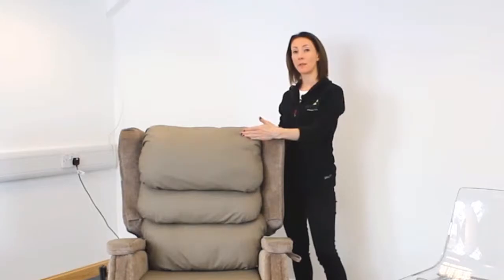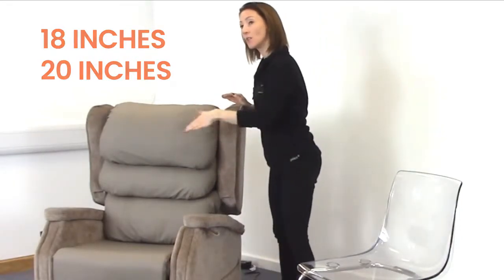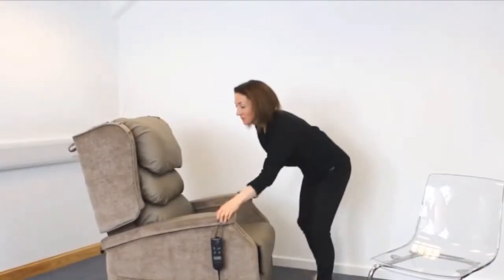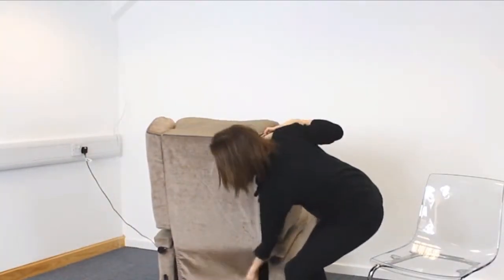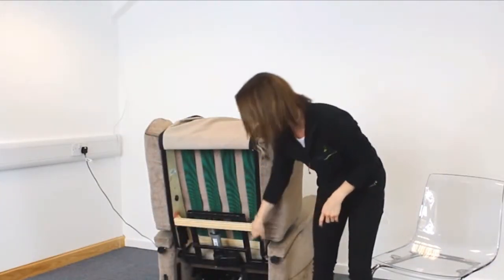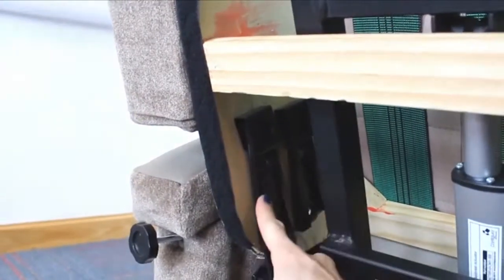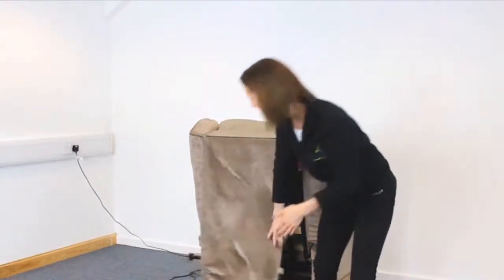For the seat depth, we can reposition the backrest within two positions: at 18 inches or 20 inches. We lift the back flap and then reposition it into another bracket. Once you have changed the position of the chair to the depth that you require, you just bring the flap back and Velcro it into place.